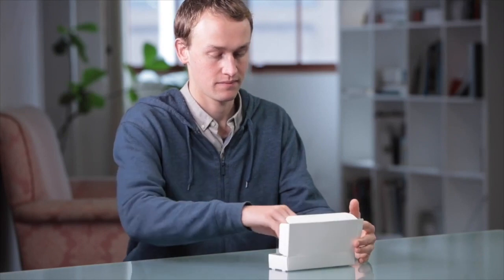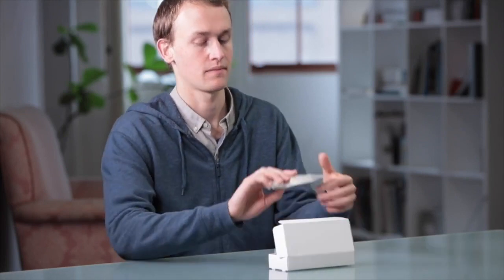How to use your Newfoundland HIV self-test. Open the box and take out the contents.